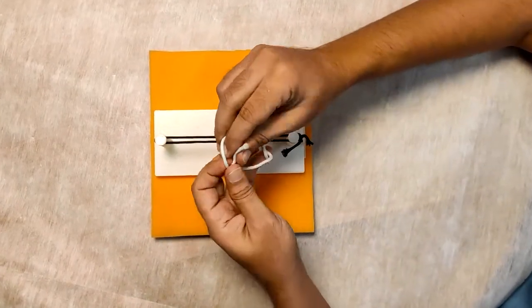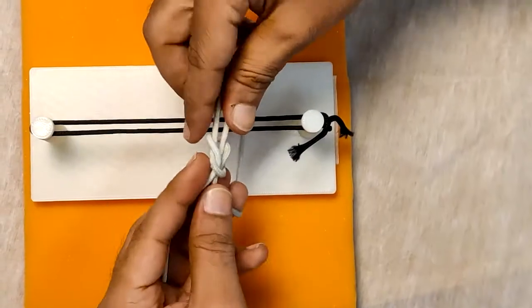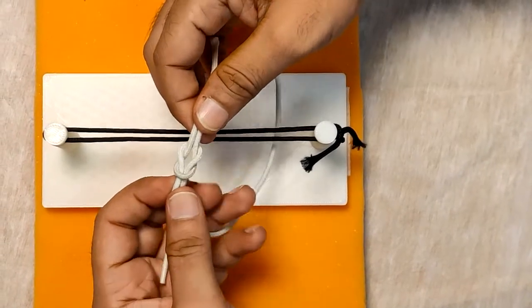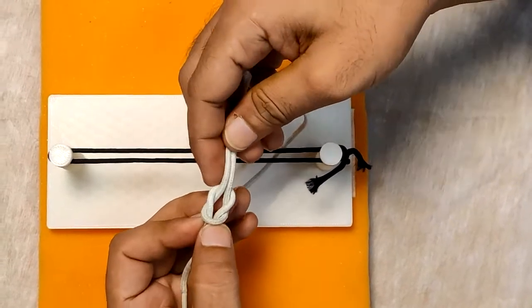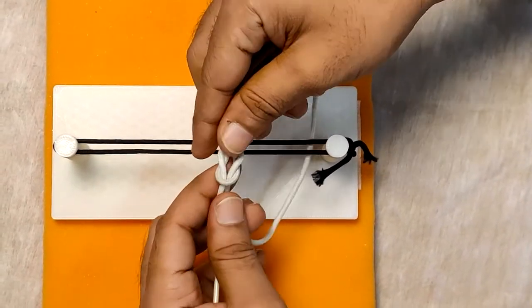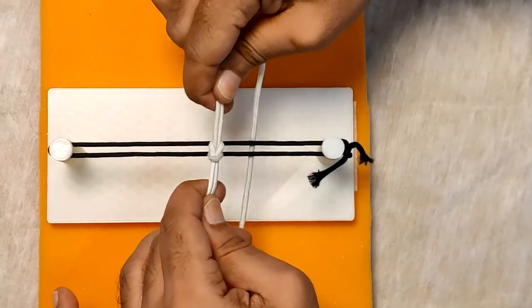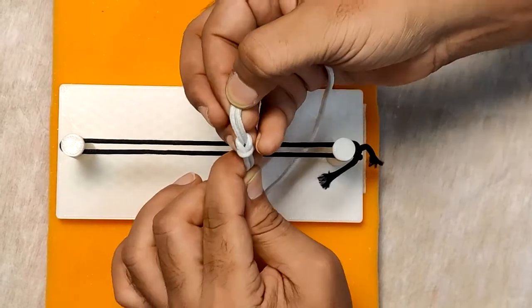have a single through knot in the opposite direction to get a knot like this. You have two ends coming out above the thread and two ends coming up below the loop. When you tighten this, it should look like this. The advantage of a reef knot is that it does not slip. It is also called a square knot.